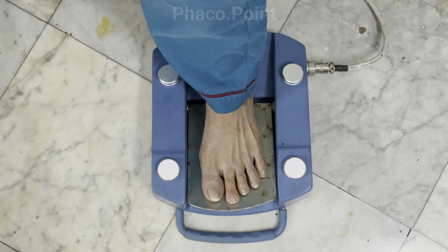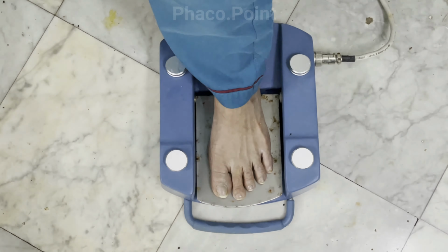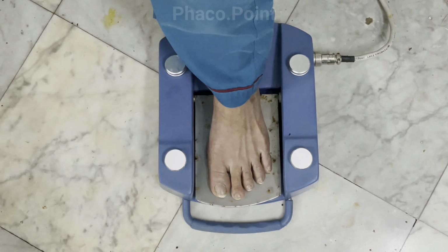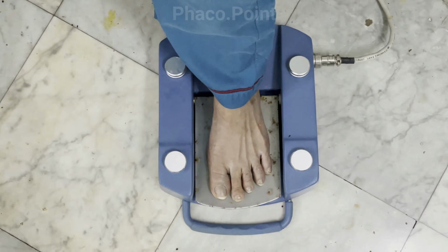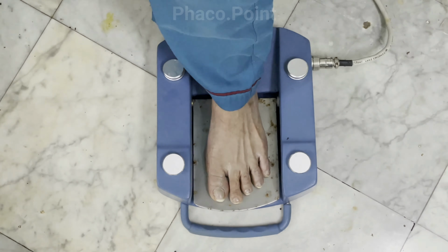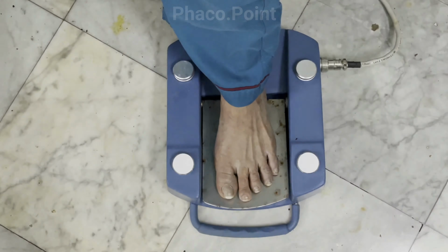So the foot pedal moves from 1 to 2 to 3. As soon as we move in foot pedal 3, the probe now impales the nucleus, that is starting just beyond the proximal rexus all the way down to the center to get a good hold of the nucleus. When the probe is adequately buried, the foot pedal now moves to foot pedal 2, which is aspiration, and holds on to the nucleus in foot pedal 2.